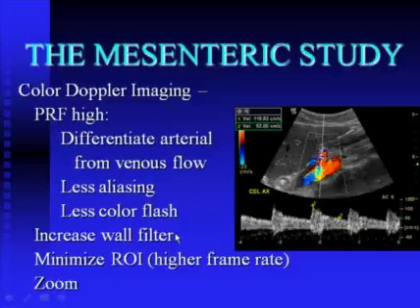You can increase your wall filter as well if you like, and if you need a higher frame rate, simply narrow your color Doppler region of interest to the area in which you are primarily concerned. You do not need color Doppler throughout the entire region of grayscale interest.